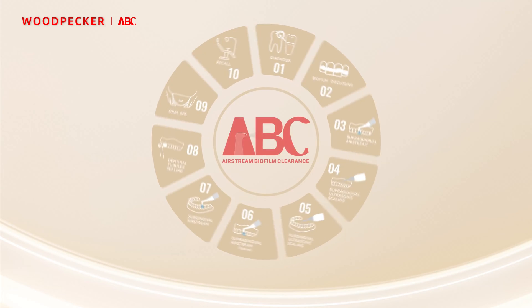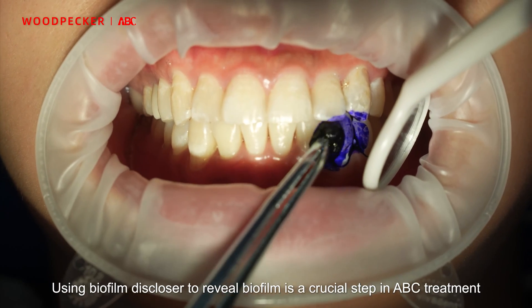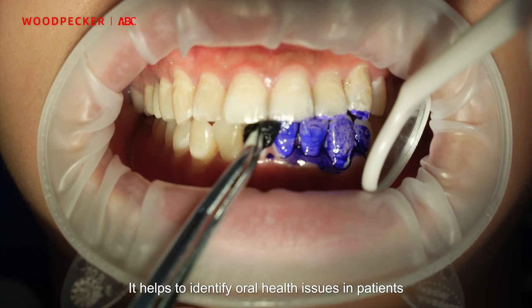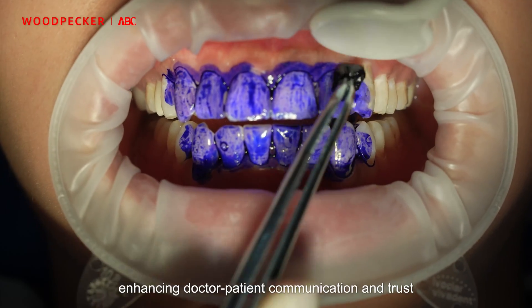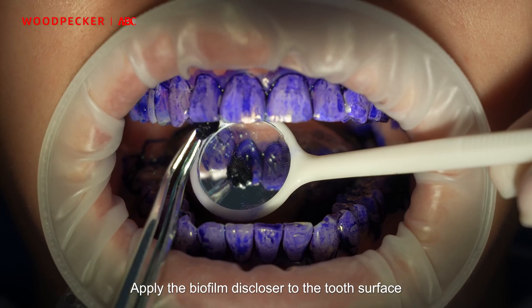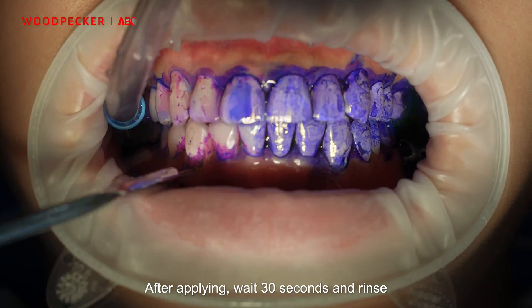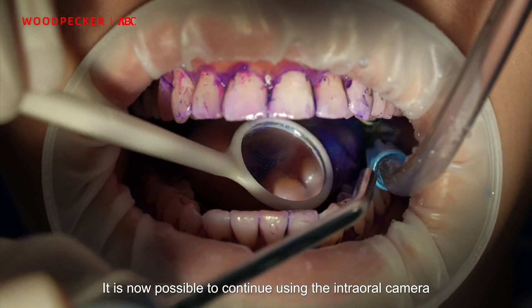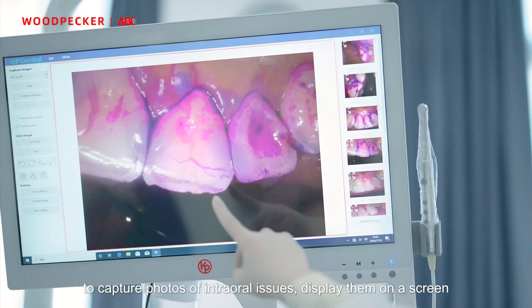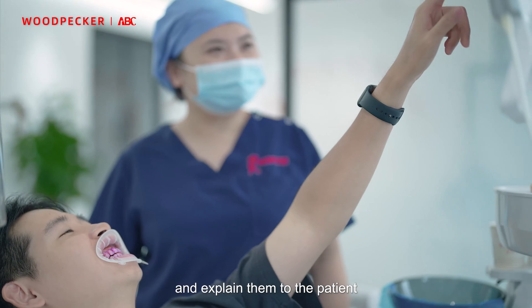Step 2: Biofilm Disclosing. Using a Biofilm Discloser to reveal biofilm is a crucial step in ABC treatment. It helps to identify oral health issues in patients, enhancing doctor-patient communication and trust. Apply the Biofilm Discloser to the tooth surface. After applying, wait 30 seconds and rinse. It is then possible to use the intraoral camera to capture photos, display them on a screen, and explain them to the patient.